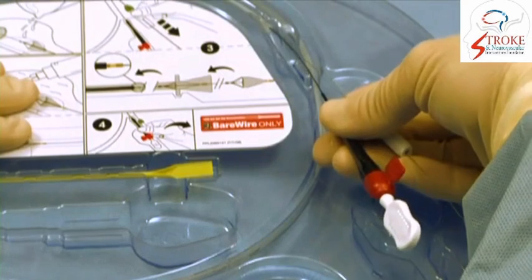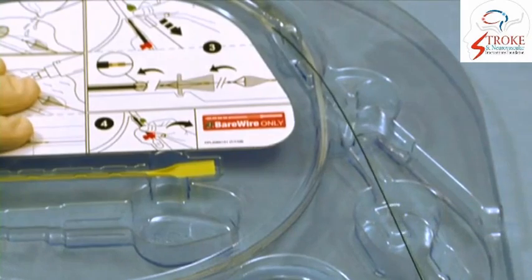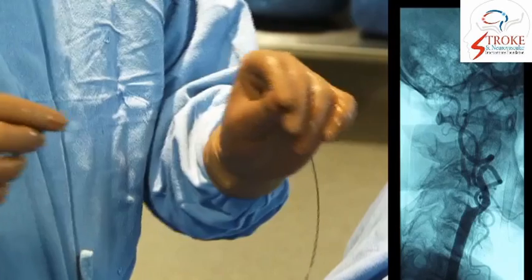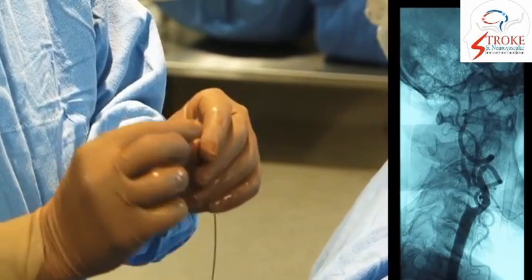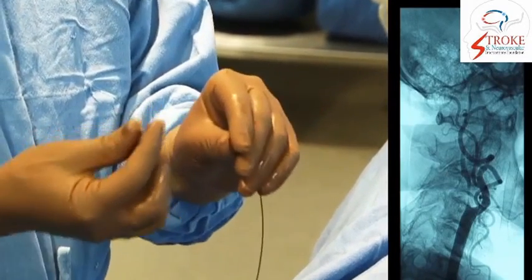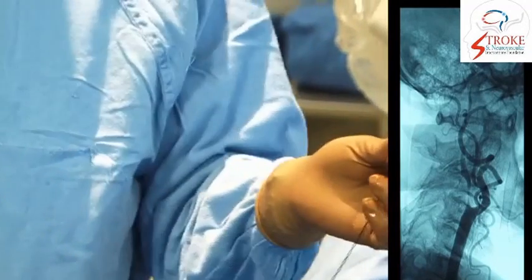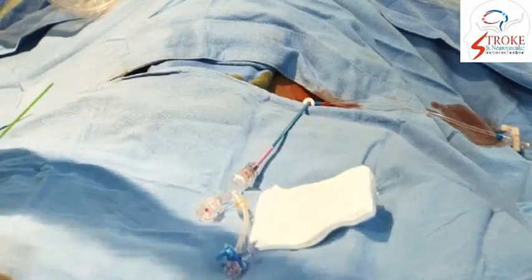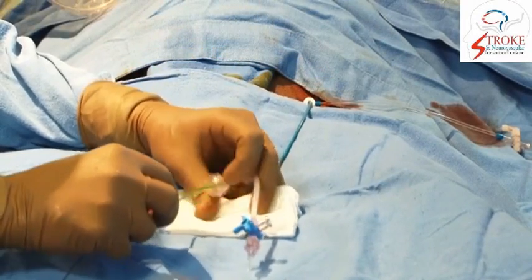Now both the wire and the catheter held together are removed. The wire was given a very gentle curve so that we can cross the stenosis. A very sharp curve will not help us here.